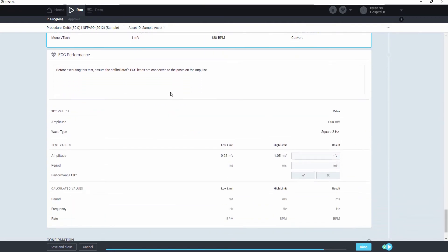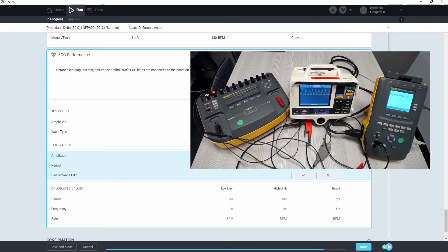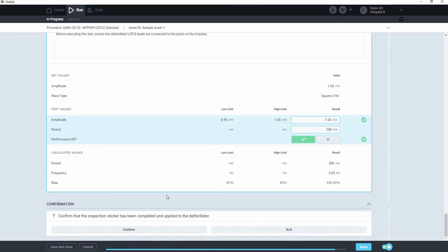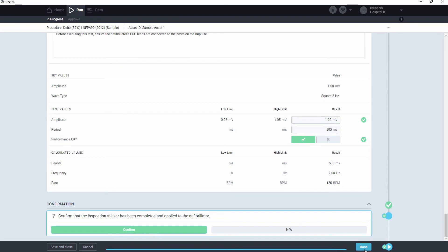Next we'll do the ECG performance test, which involves simulating a performance wave, in this case square 2Hz, and then printing out from the defib and measuring the dimensions of the wave. Then we can confirm that we've done the inspection and the sticker on the device. And that's it.